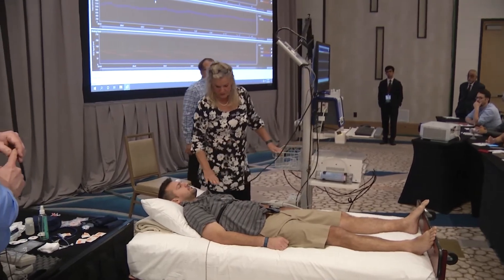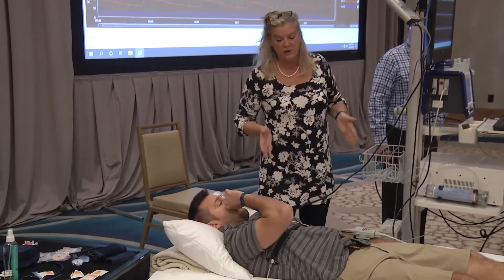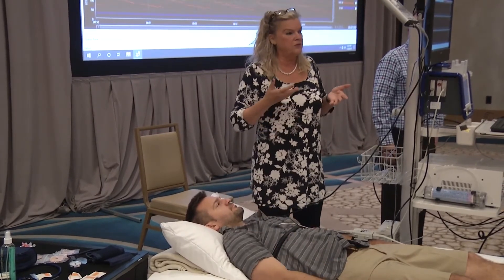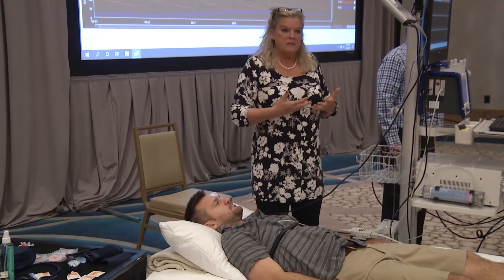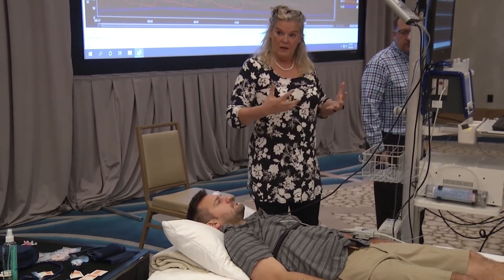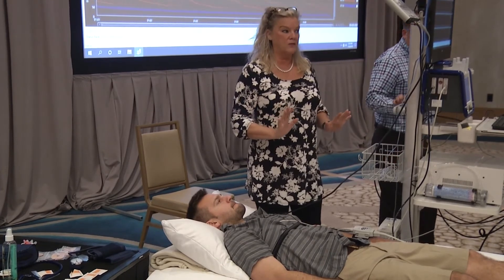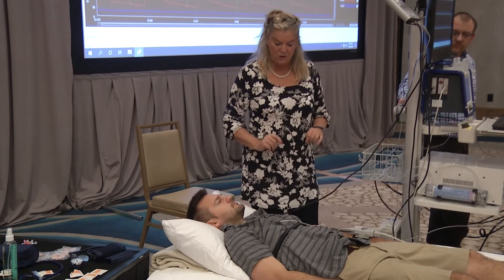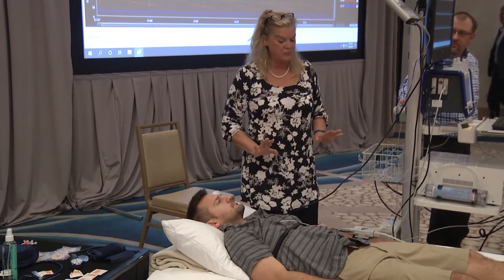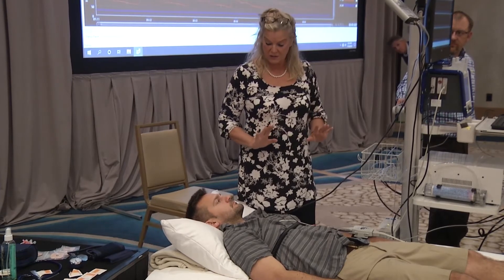We're going to do a series of deep breathing. You're going to watch the sine wave. When the green bar is going up, you'll be inhaling in through your nose over a course of five seconds — all the way up, nice big deep chest breath. When the bar goes down, you're going to blow it out through your mouth. We're going to do it eight times in a row. I'm going to get a resting baseline first, and I will tell you when to start, then we'll do it until I tell you to stop.